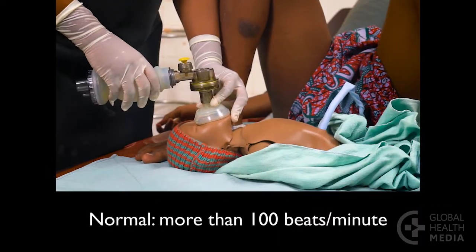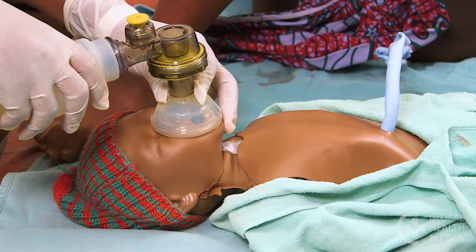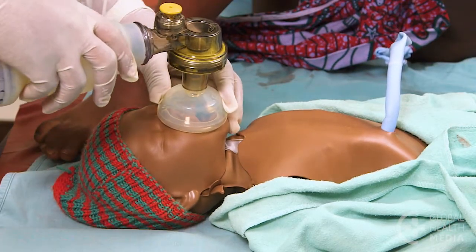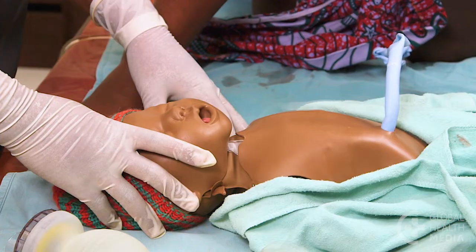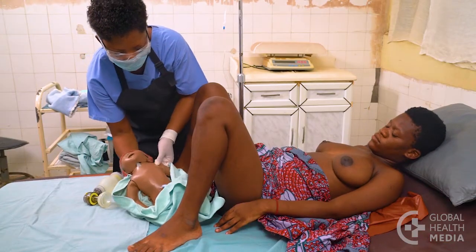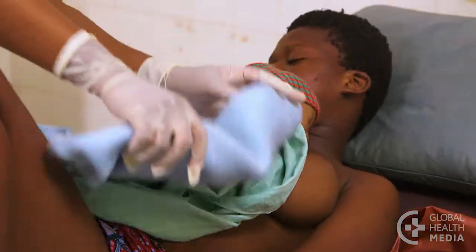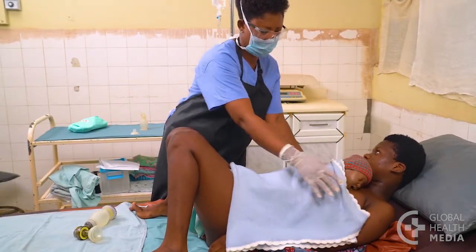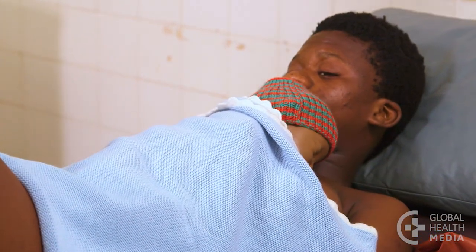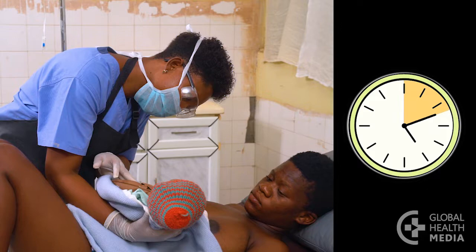A heart rate of more than 100 is normal. Continue breaths and watch as the baby starts to take her own breaths. Stop giving breaths when the heart rate stays normal and the baby is breathing well on her own. Reassure the mother that the baby is breathing now. Put the baby on the mother's chest, skin to skin, and cover with warm blankets. Encourage breastfeeding as soon as possible. A baby who needed resuscitation is especially vulnerable in the first hours after birth — check the baby's breathing and temperature every 15 minutes until the first complete exam, between one and two hours after birth.